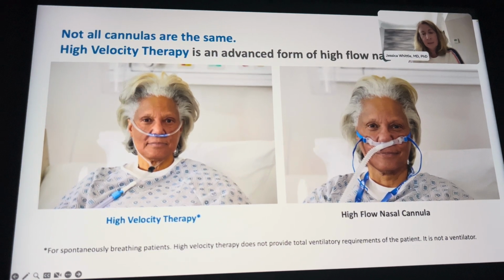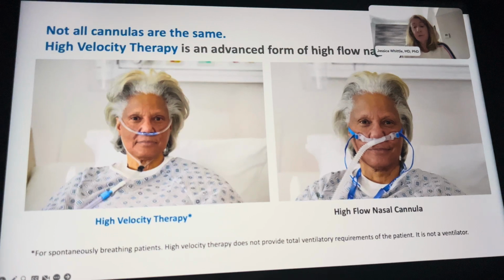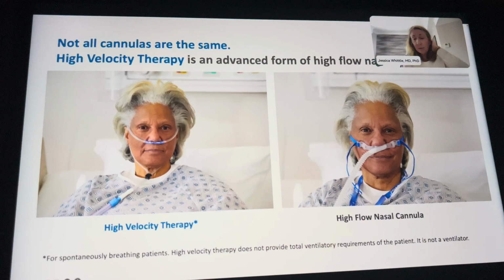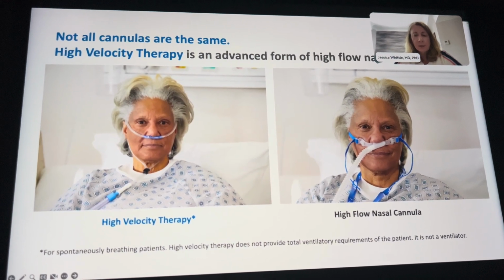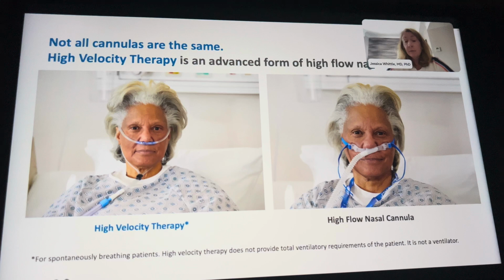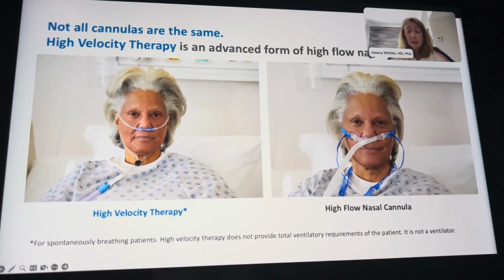One of the practical problems sometimes with a mask therapy in the United States is that even if you, as a clinician, order it or start it on a patient, oftentimes the BiPAP or CPAP is not humidified initially. And sometimes that patient won't receive humidity for that entire shift or through the night or until things are calmed down or they're in a more stable environment where the respiratory professionals can intervene and apply humidity. We know that you get mucosal damage in as little as 30 minutes. And so these patients who are going sometimes 4, 8 hours or more a day without humidity, we're really damaging their ability to clear their secretions.